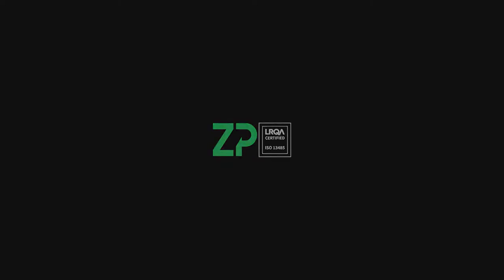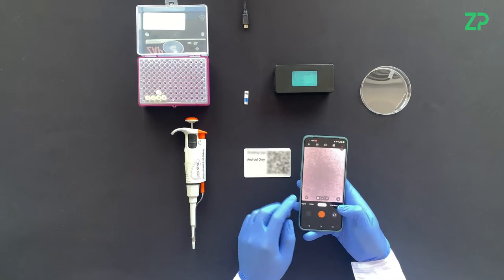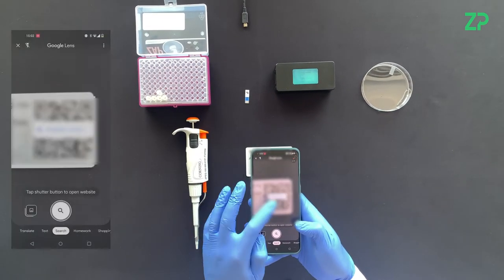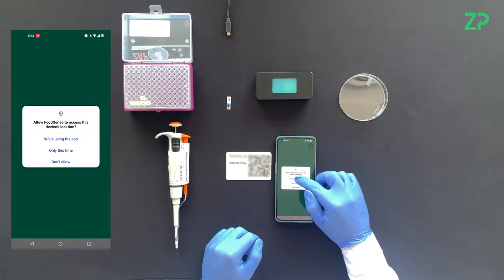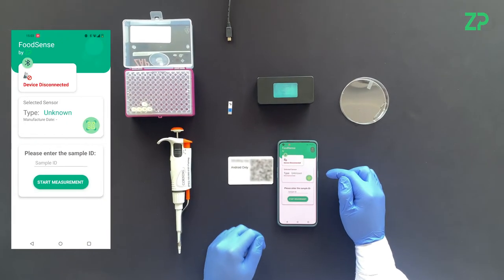Hello. Welcome to a demonstration of Simran Peacock's electrochemical product workflow. Our apps are possible to download and install using a QR code. Once development is complete, an app can be downloaded on the Google Play Store or on the App Store.